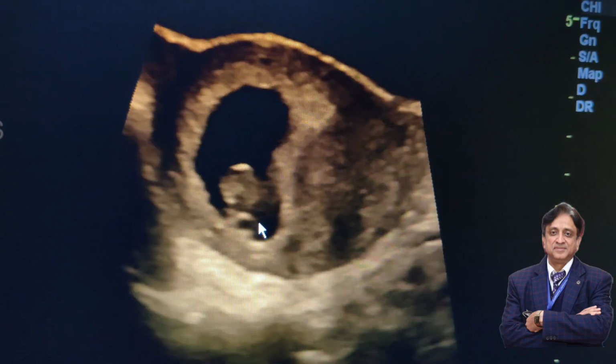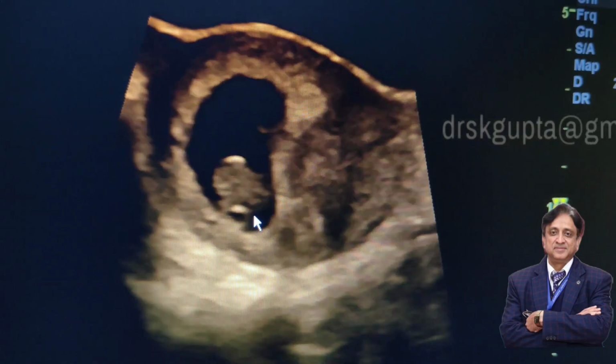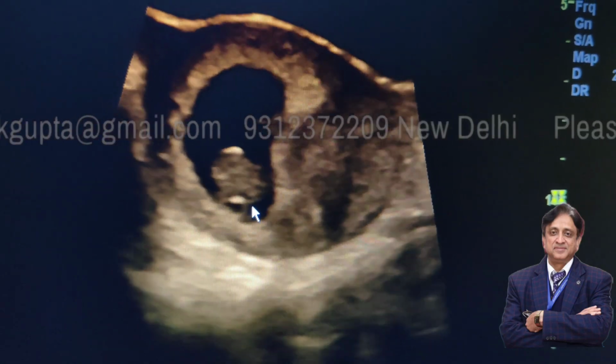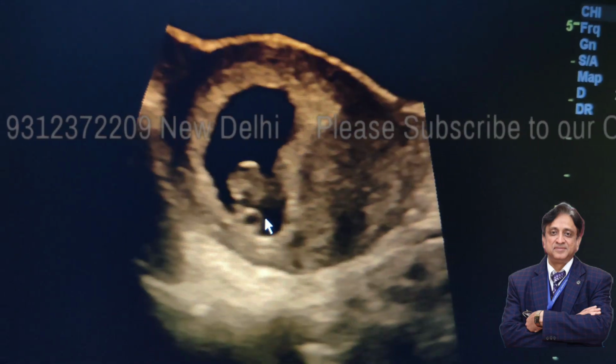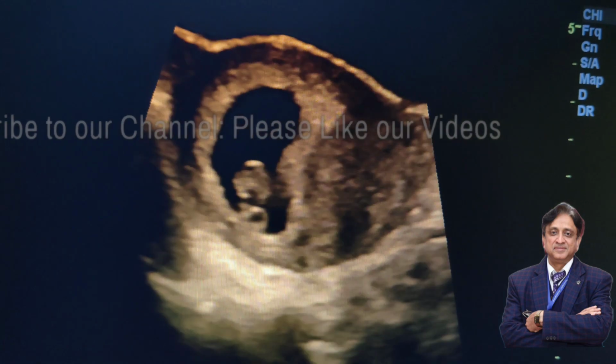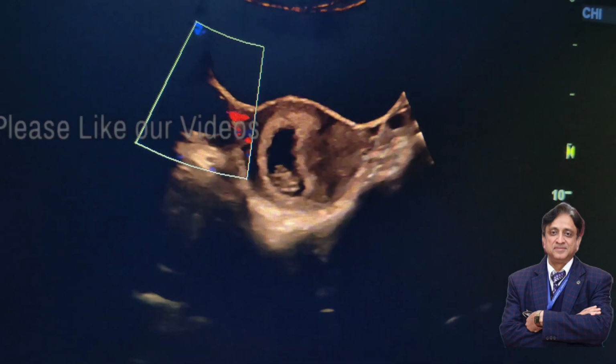You should not forget to look for another sac, because sometimes having seen one sac might bluff you, and there might be another small sac in the uterus giving rise to a twin pregnancy. But here in this patient we found that there was only one sac.